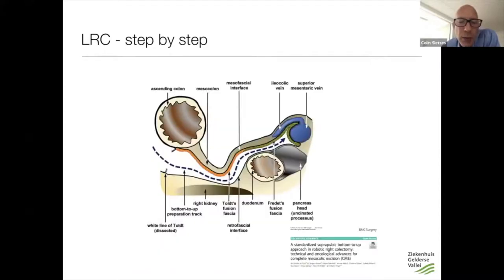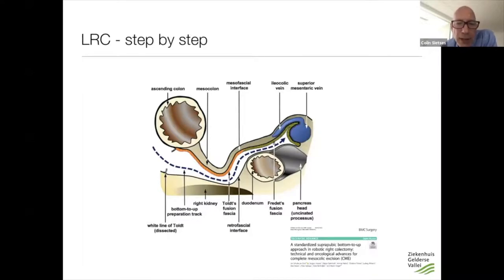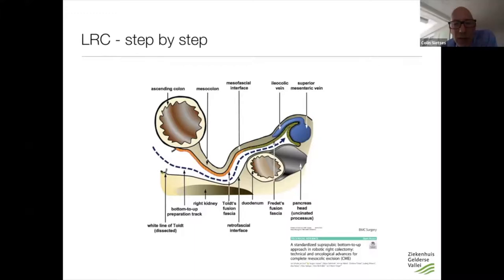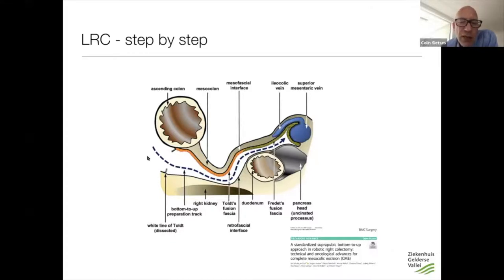What I do is I start with the mesentery of the small bowel and create a plane behind the meso of the ascending colon, all the way up to the duodenum and the mesentery of the transverse colon. I leave the white line of Toldt intact, so my specimen always remains in the same anatomical position and I don't get confused by rotation of the specimen.